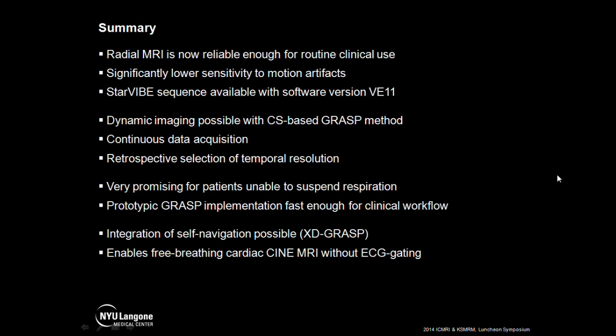Grasp can also be combined with an additional motion compensation mechanism, which we call XD grasp. And as I just showed you, this XD grasp technique allows us to do cardiac MRI during free breathing without any ECG gating, and therefore it can also help us to improve the reliability of clinical cardiac MRI.